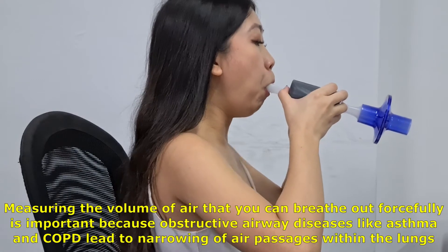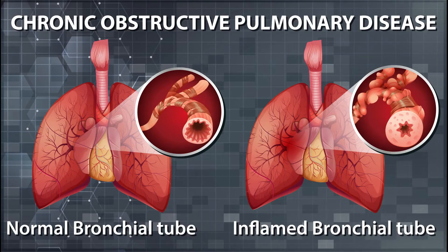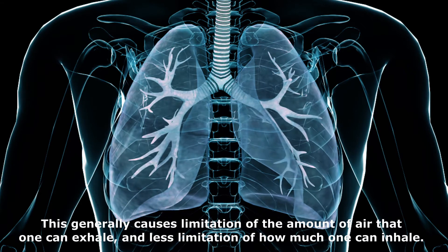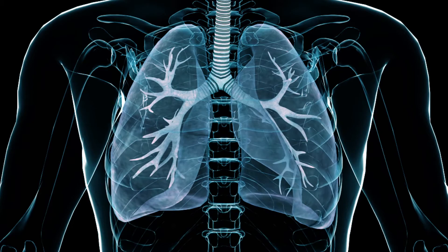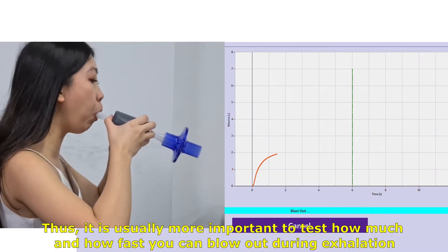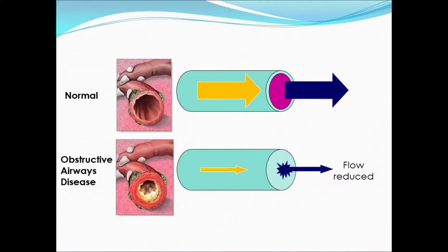Measuring the volume of air that you can breathe out forcefully is important, because obstructive airway diseases like asthma and COPD lead to narrowing of air passages within the lungs. This generally causes limitation of the amount of air that one can exhale, and less limitation of how much one can inhale. Thus, it is usually more important to test how much and how fast you can blow out during exhalation.